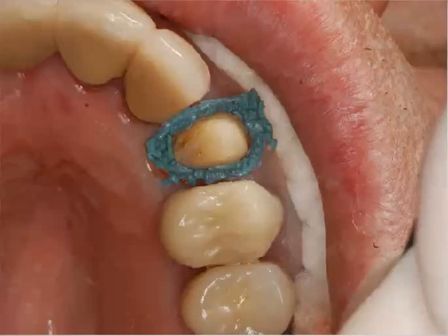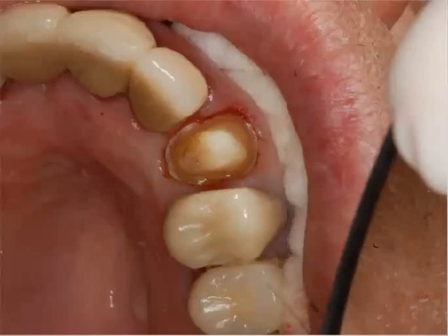There are other ways too we can gain some tissue retraction, some relaxation, just depending on the nature of the preparation as far as the depth. This is an aluminum chloride paste or clay material. If you have margins which are just slightly subgingival, this does a good job of getting some relaxation, some shrinkage. It'll also help decrease some of the potential hemorrhaging if there's anything there.